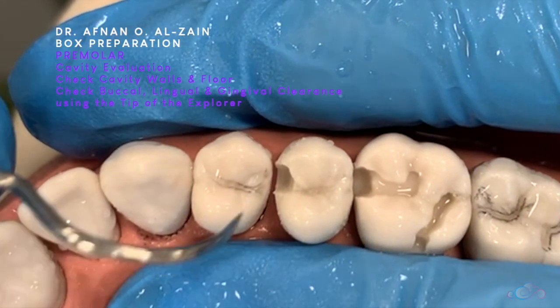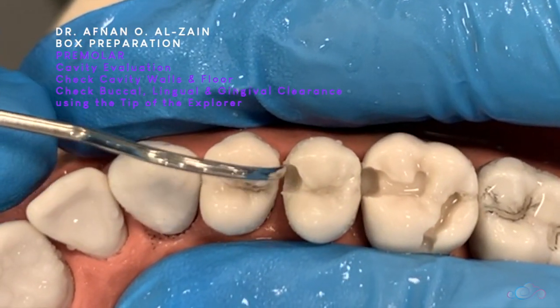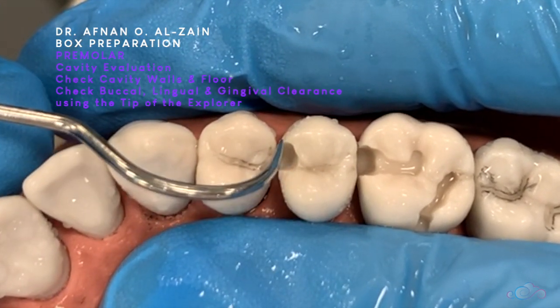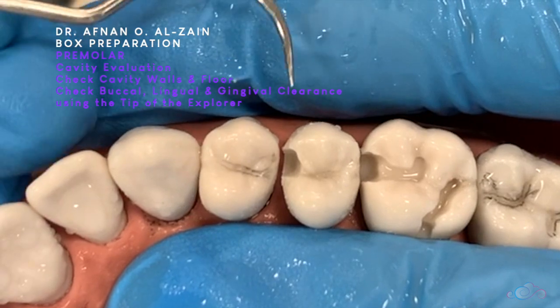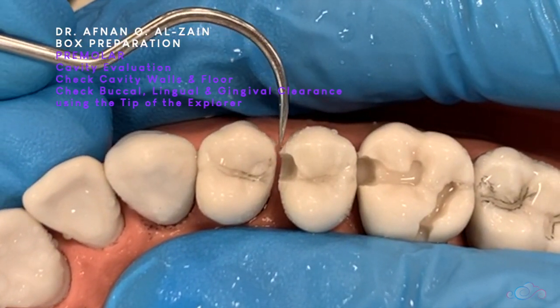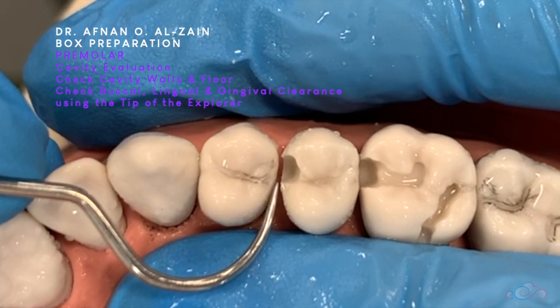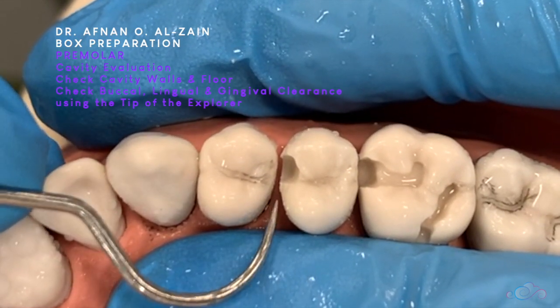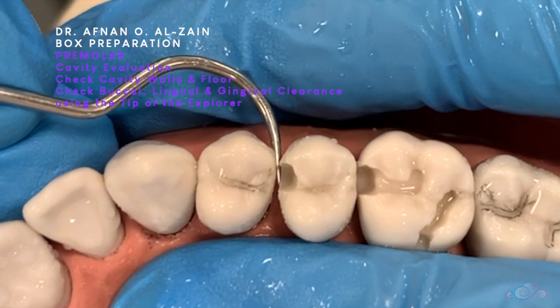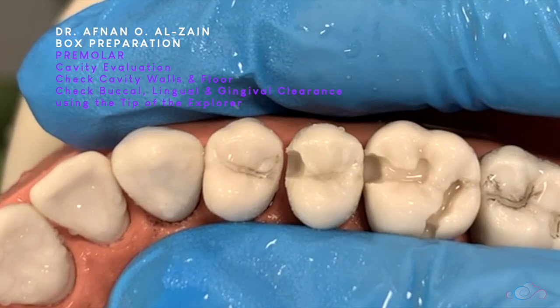As needed, we can continue finishing the cavity. This is a box-shaped cavity. We can see the buccal clearance with the tip of the explorer, and we can see the lingual clearance as well. This is how we cut the box in the proper way.